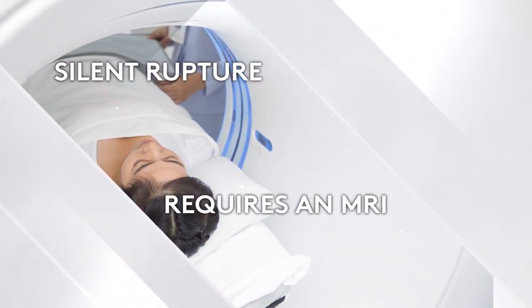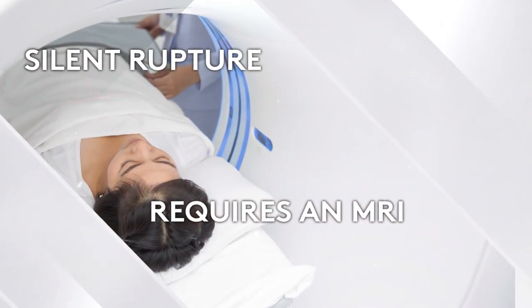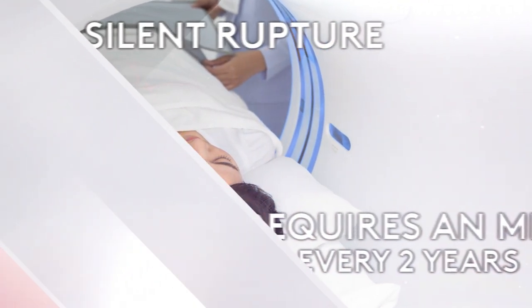If a silicone gel implant ruptures, it's silent and requires an MRI to diagnose. That's why the FDA recommends women with silicone gel implants undergo an MRI every two years for the life of their implants.